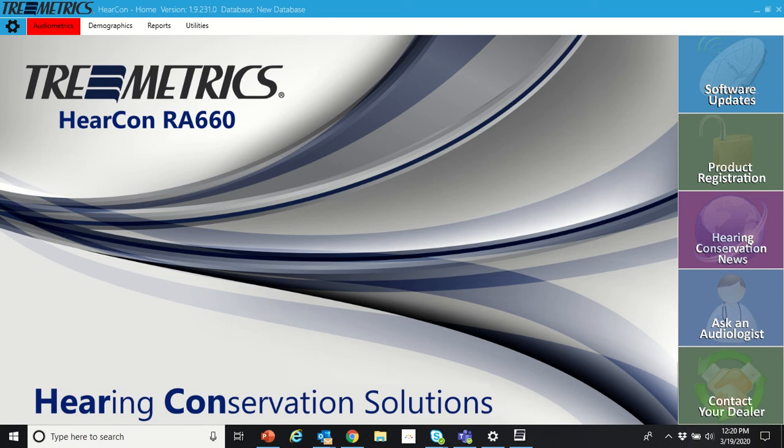Hey, this is Sean Kelly. I'm the National Sales Manager at Tremetrics. We're going to go over the RA-660 audiometer with the HearCon software and how the real-time octave band monitor or room monitor functions.